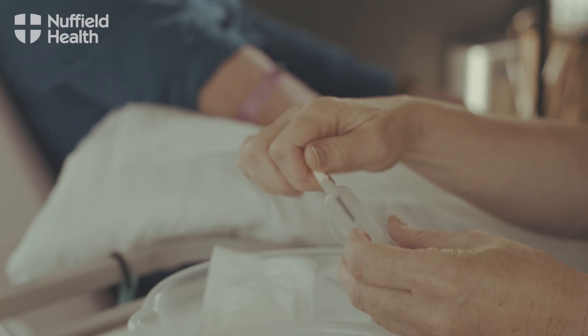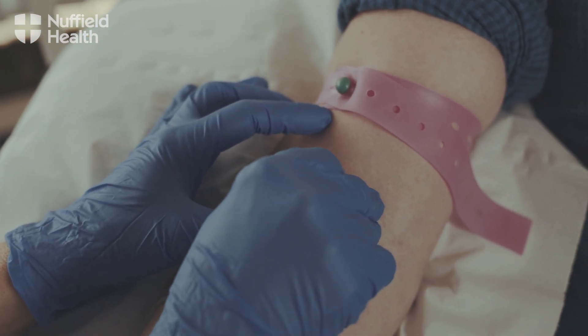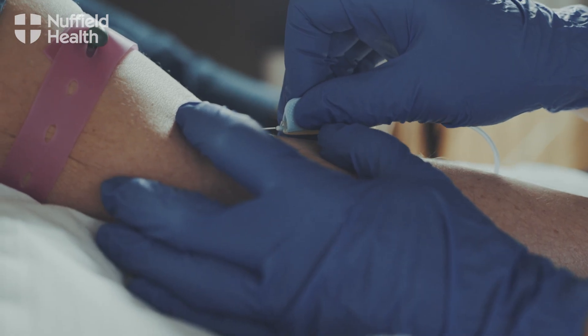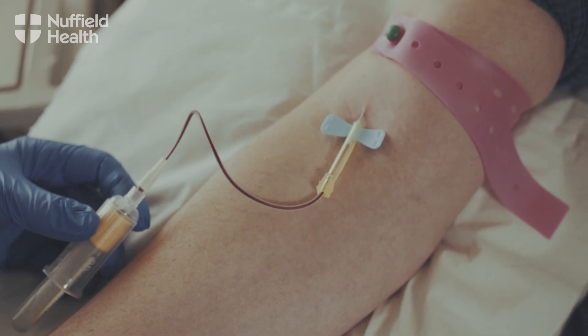Whilst we're doing that we prepare the kit and the needle. We use a vacuum system so the needle is attached to a small tube with a vacuum receiver on the end. That needle is then just popped into the vein — it's just a little scratch when the needle goes in, most people don't really notice. The line is already attached with the receiver for the vacuum bottle.